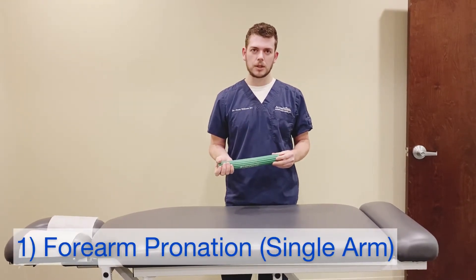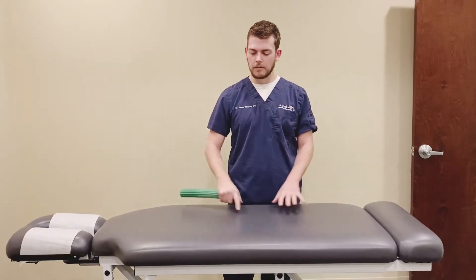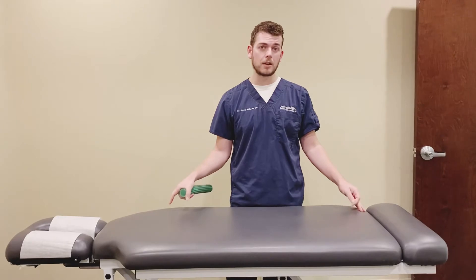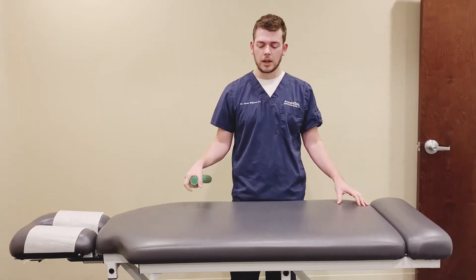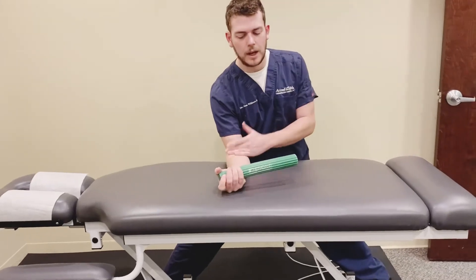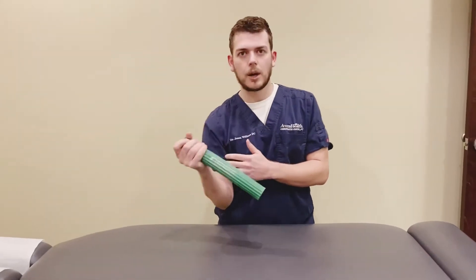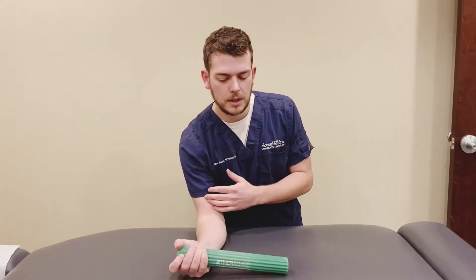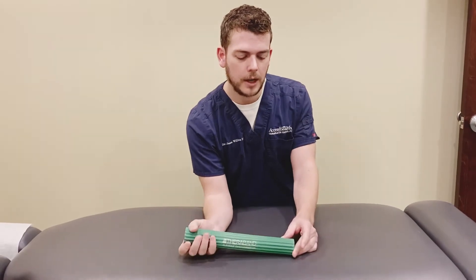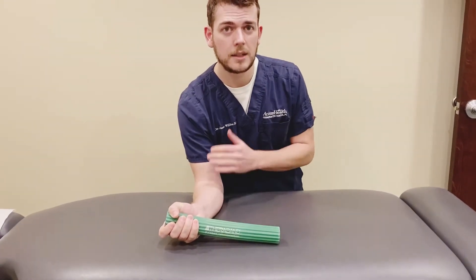The first exercise we're going to do is a single arm pronation. I have a table here, but you could use a regular table or kneel down and use your bed or a couch. I want something that's going to allow you to lock your elbow against it so that you're not using your upper arm to assist in the exercises. So grab the Flex Bar at the end and put some resistance down against the table.